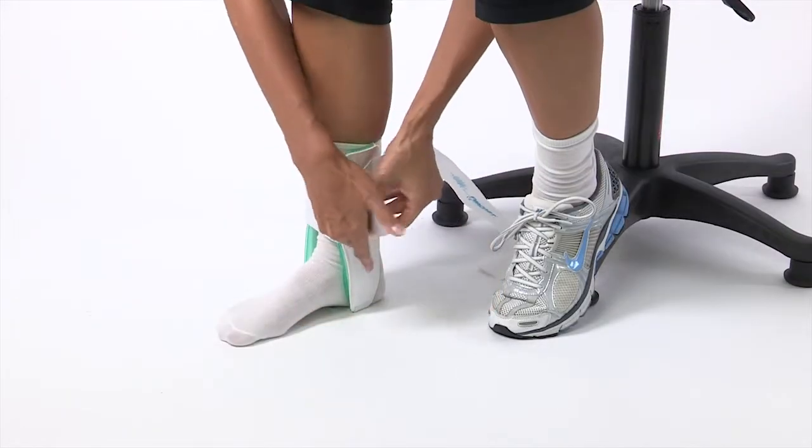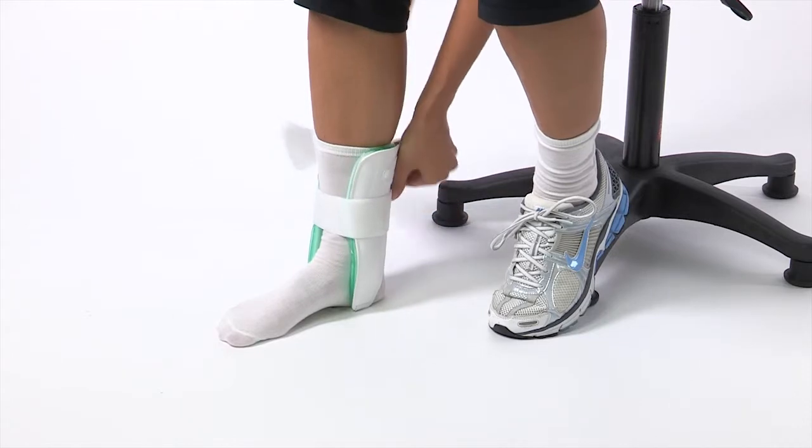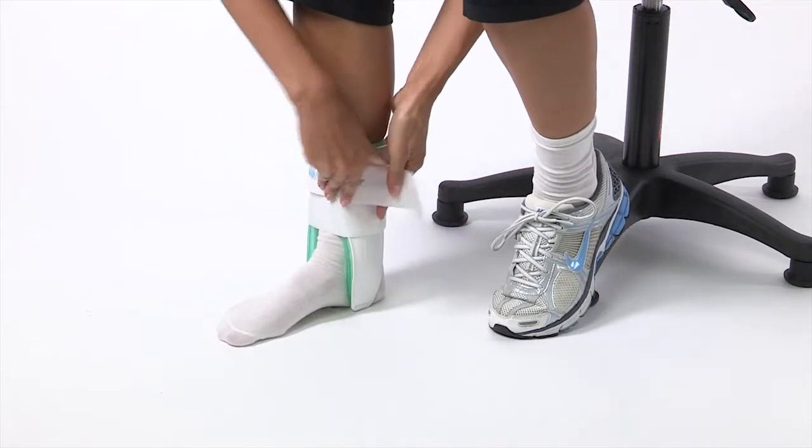If you sprained your ankle or have chronic ankle instability, the Aircast Air Stirrup can help. The Aircast Air Stirrup is the number one prescribed ankle brace in the world. Its superior performance has been documented in over 100 medical journals.